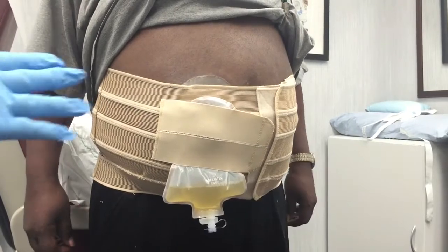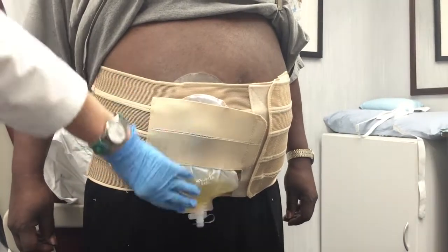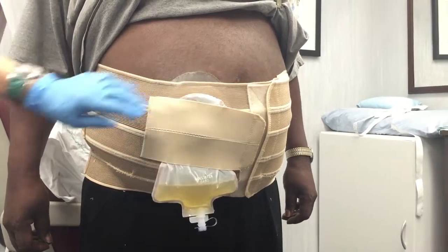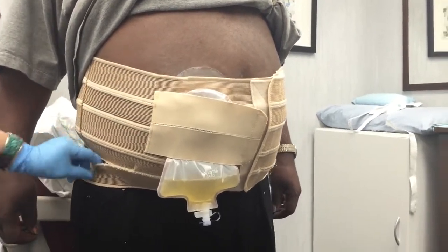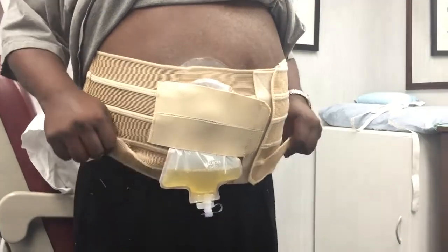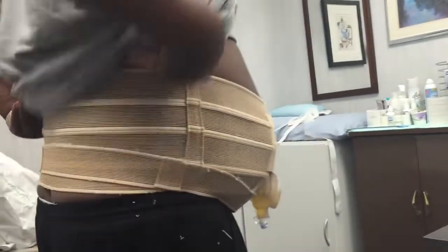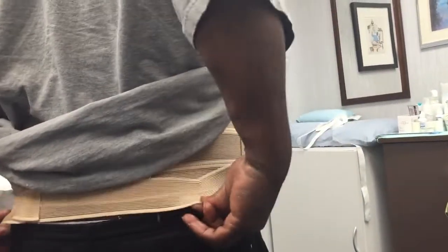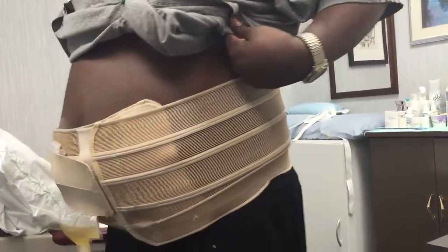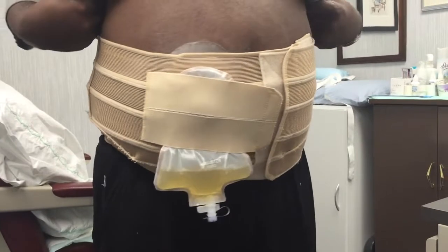Now he's put his belt on and he's done a really good job. He's got it nicely supported in the front, nice support underneath, and his little flap on there to support so that he doesn't bulge through the opening. You can see where the belt is down below, and now he's going to show how to modify and adjust it. He takes that lower strap and pulls it up, hiking it up all around the back — very nice. Now when he sits down, it will be out of the bend of his groin, giving cupping and uplifting and helping to support that hernia.